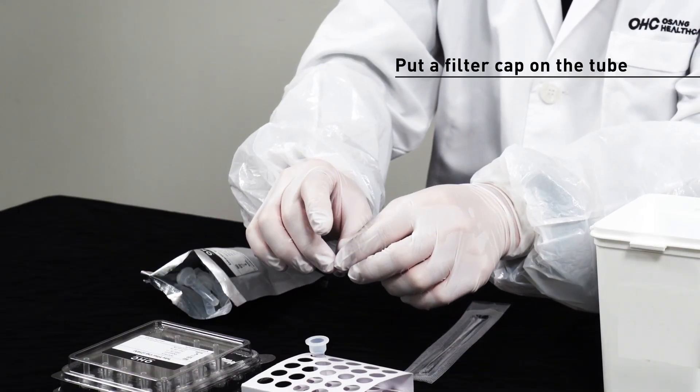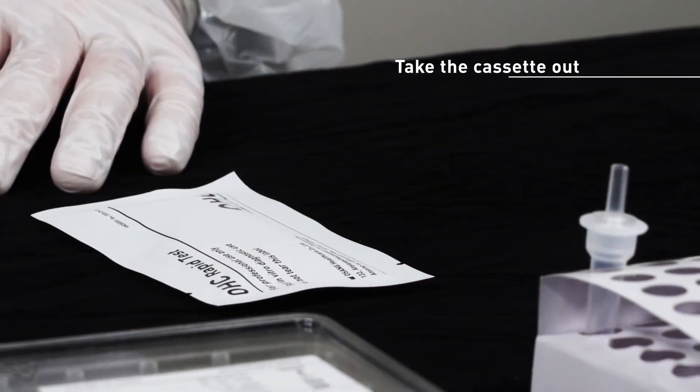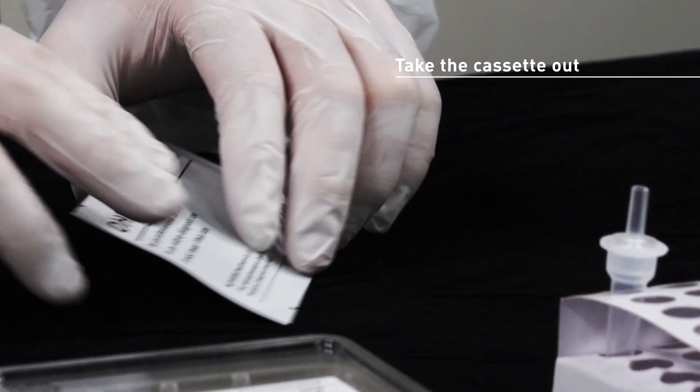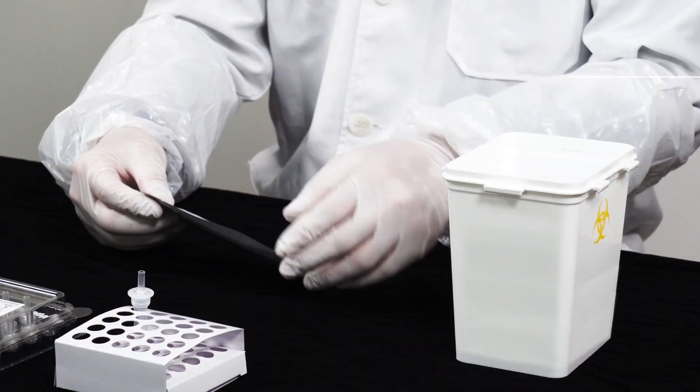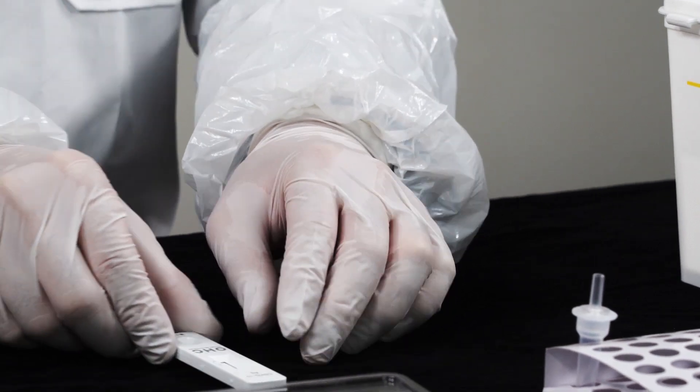Put a filter cap on the extraction buffer tube containing the sample extract and close it. Open the pouch at the notch and take the cassette out of the pouch, then place the cassette on a clean and flat surface.